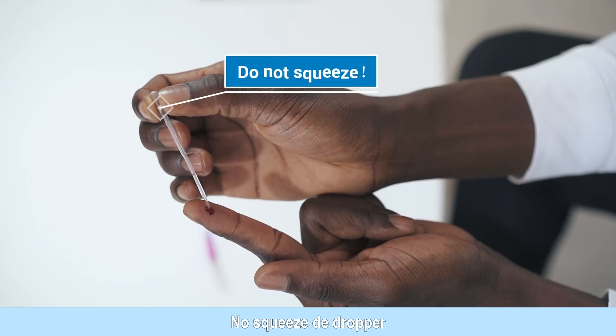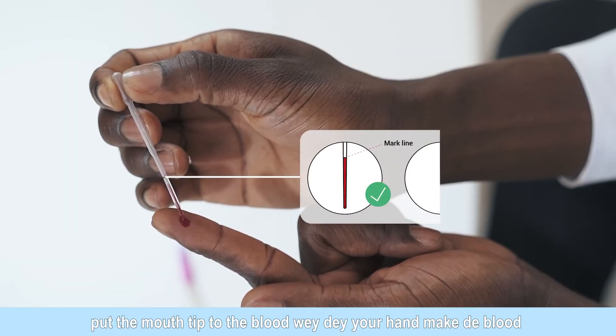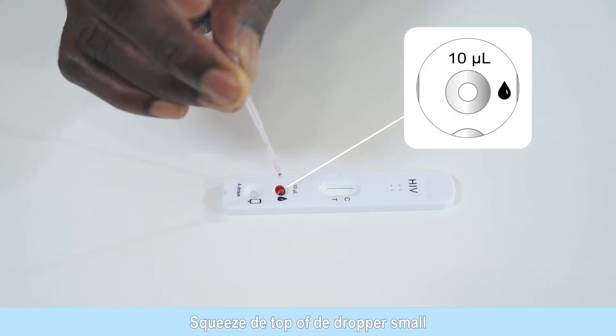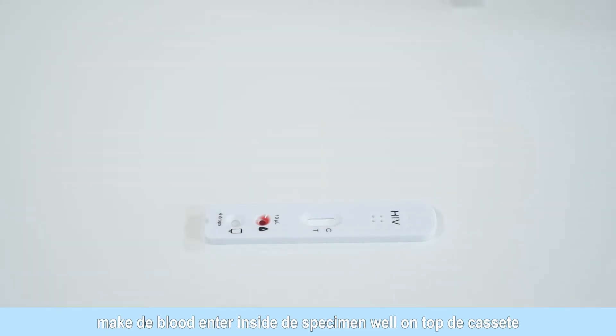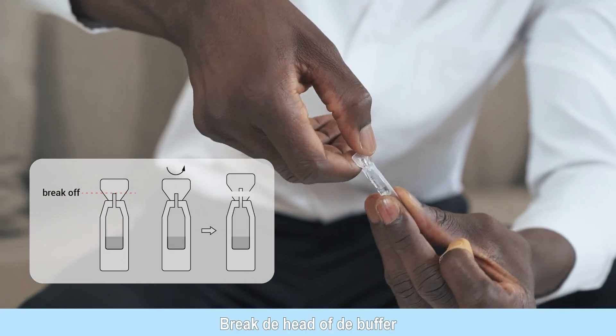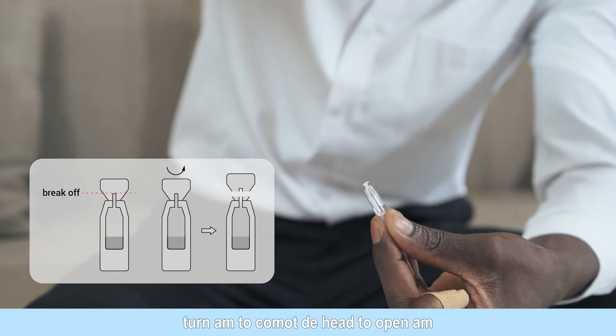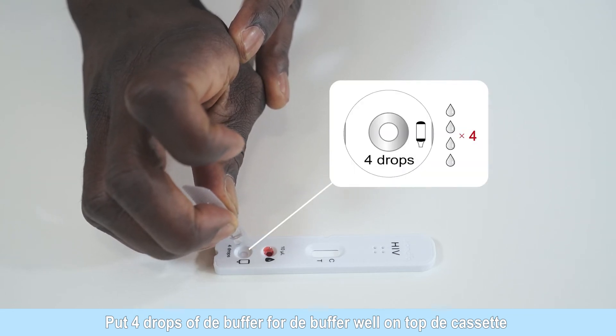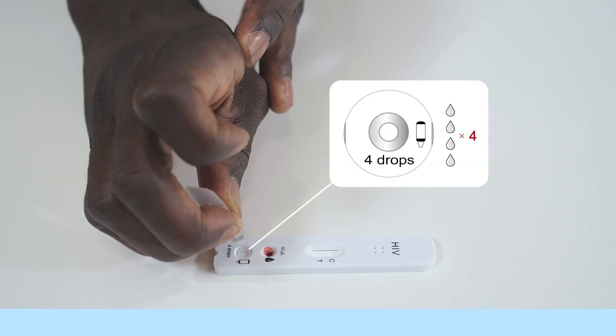Do not squeeze the dropper. Pull the tip to the blood and fill to the mark line. Squeeze the top of the dropper and add all of the blood into the specimen well. Break off the head of the buffer along the crease line and then twist it off. Add four drops of buffer into the buffer well vertically.